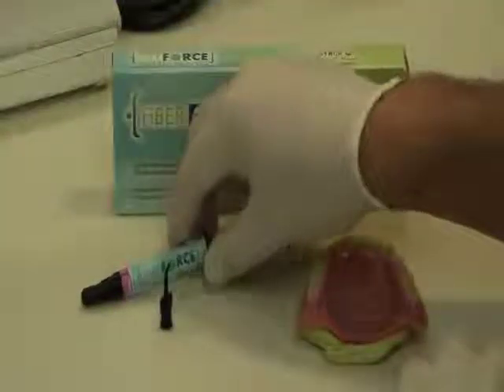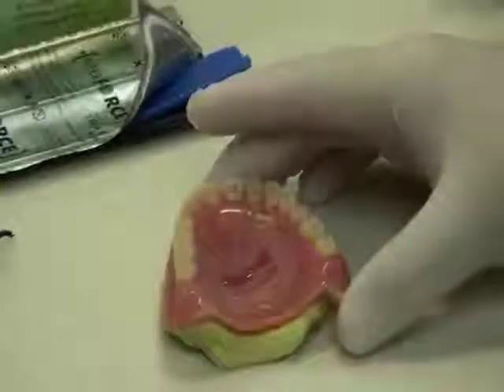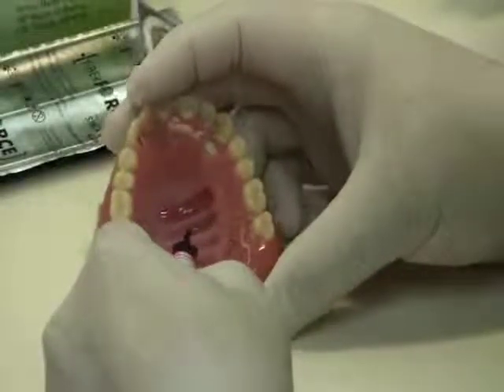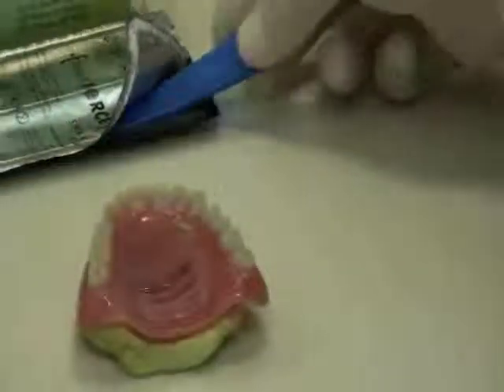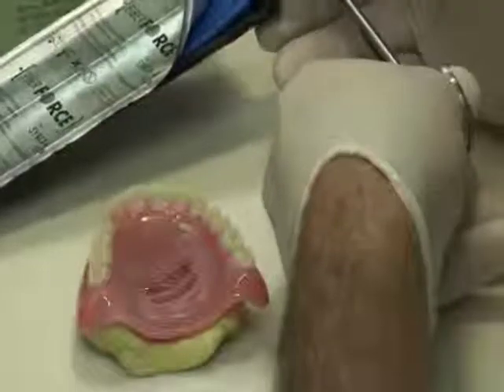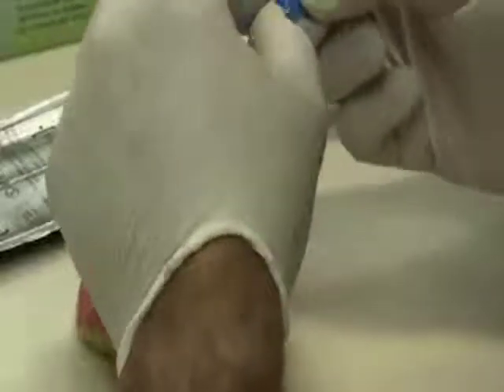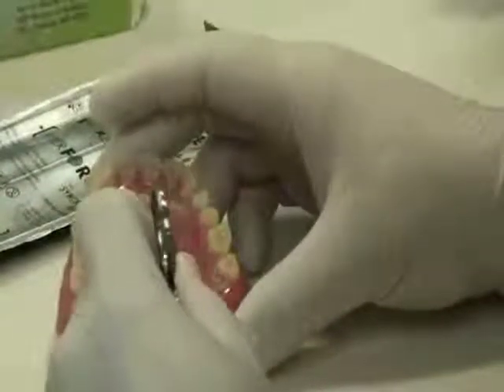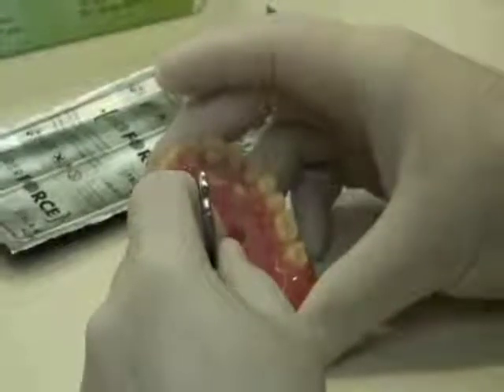The third repair technique uses only the Fiber Force Pink Light Cure Resin. Take the light cure resin and fill the bottom of the space you created. Now cut the Fiber Force material and place it into the bottom of the space, pressing the Fiber Force into the base.